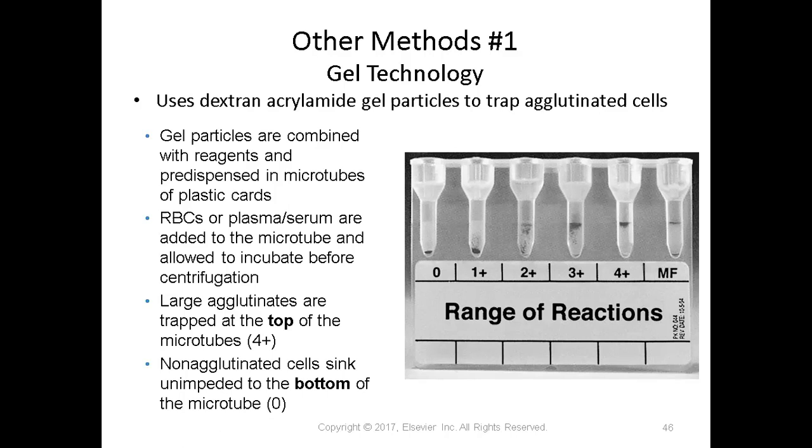Okay, but also a perfect example of a mixed field reaction would be when we're doing an anti-human globulin test that tests as negative and we're adding check cells. Okay, so let's think about this. This is a good way to review our check cells. So with our anti-human globulin test, the red cells that were originally in the test system did not agglutinate, okay, and it looks negative, so those cells would be on the bottom.